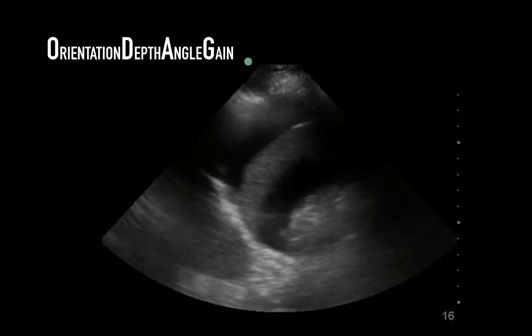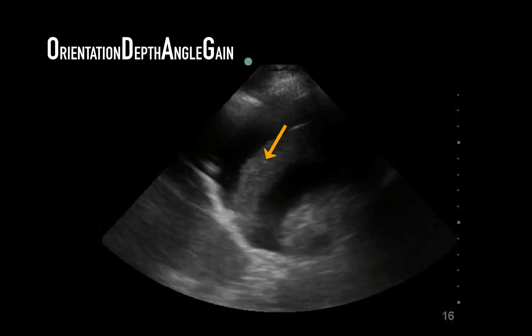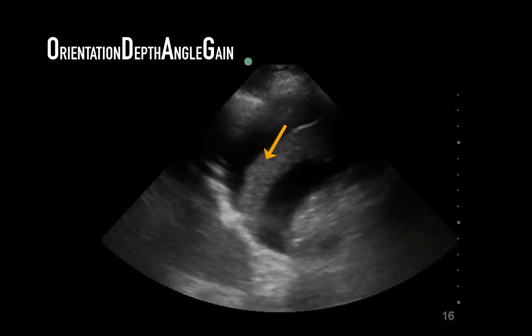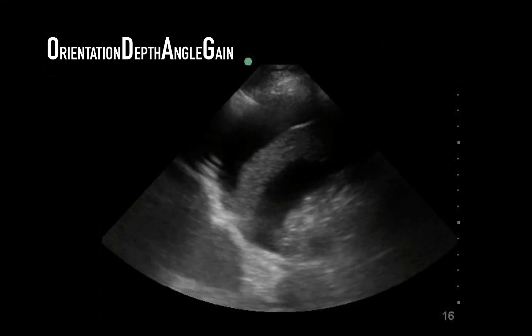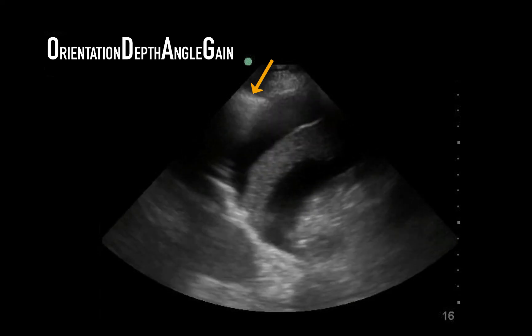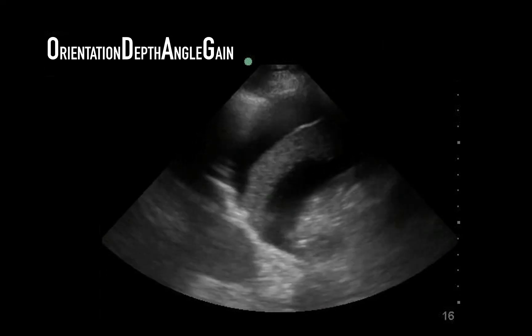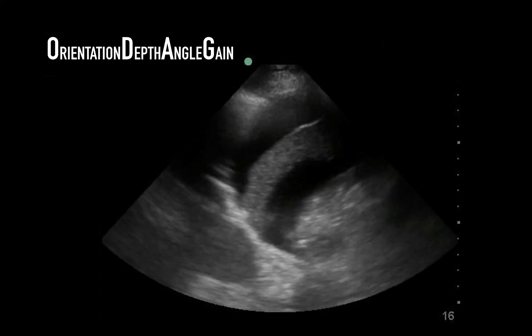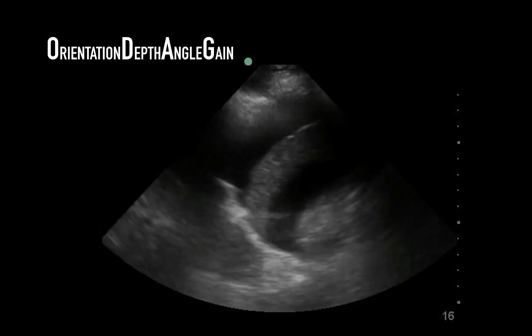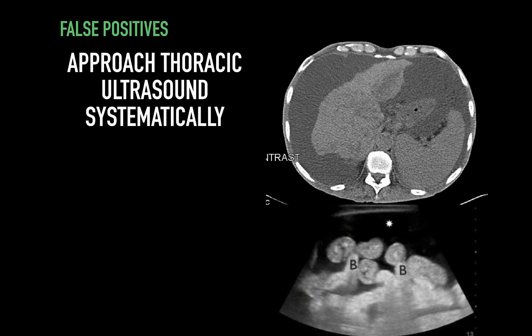Here we can see the diaphragm moving, delineated by this structure. Below that, the appearance may be easily mistaken for lung — but in fact, this is an atrophied spleen marinating in an anechoic space of intra-abdominal free fluid. On the screen left, we actually see lung sliding; the actual pleural space is above this line, and there is much more fluid below the diaphragm than above it. This emphasizes why you should be clear on your landmarks and approach ultrasound systematically. If there's previous data like a CT showing ascites, be aware of such confounders.